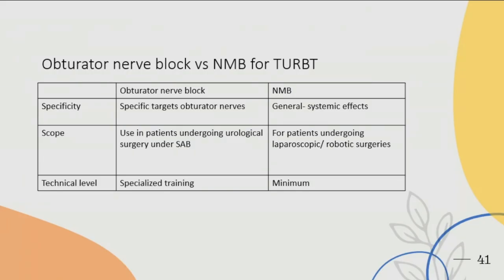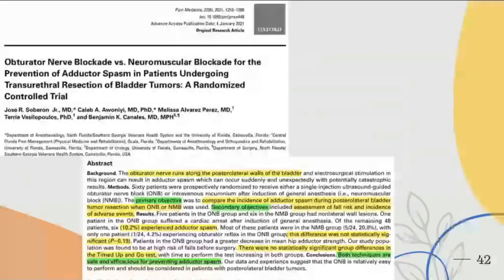And on the technical level, obturator nerve block is not performed regularly, on a day-to-day basis. So actually you need to be trained for it. Paralysis, just give it.